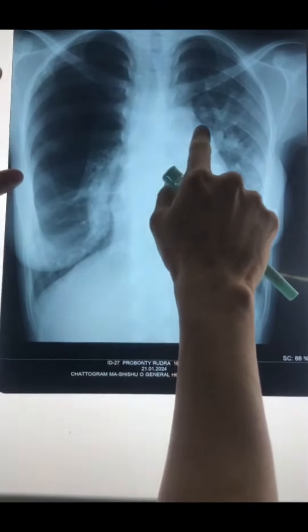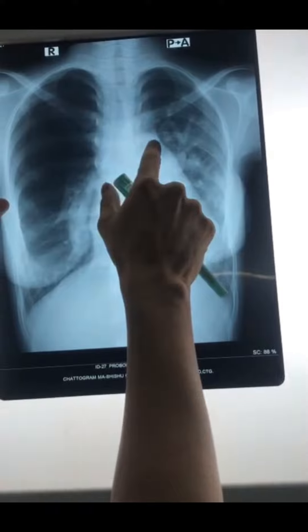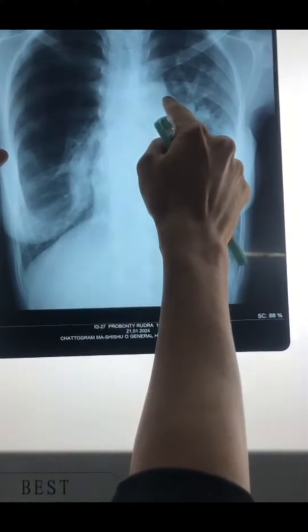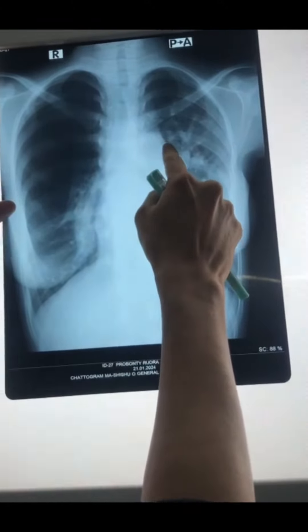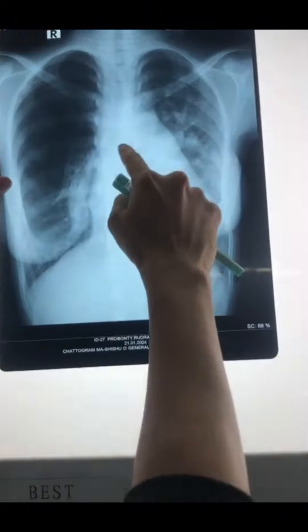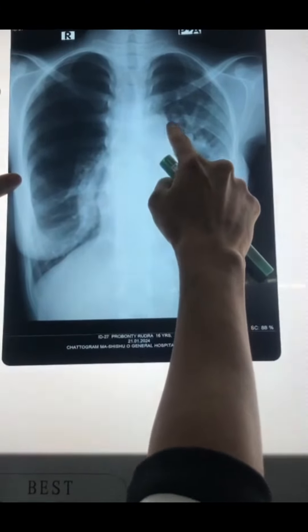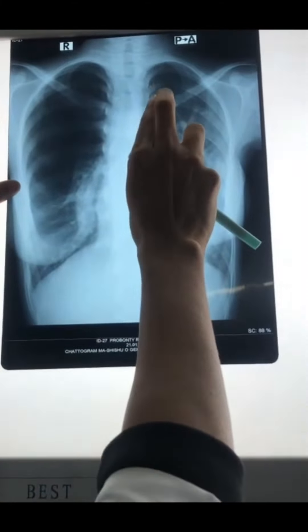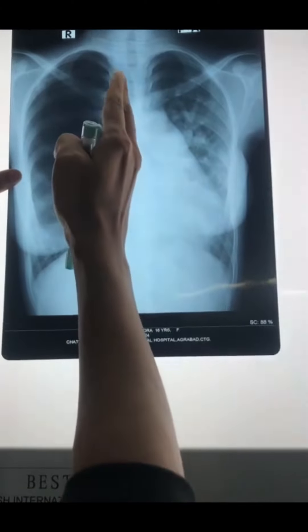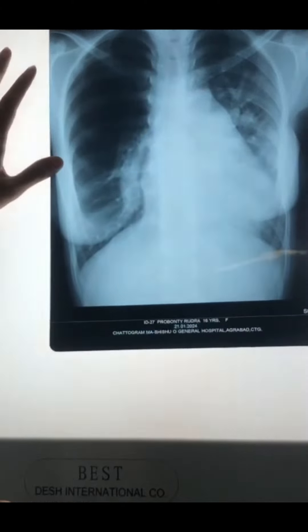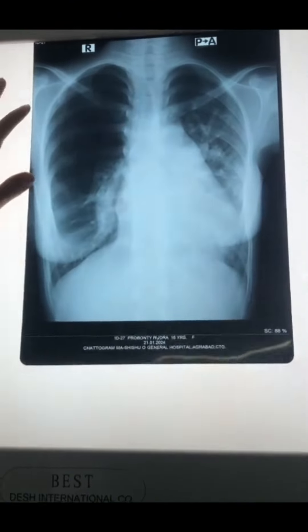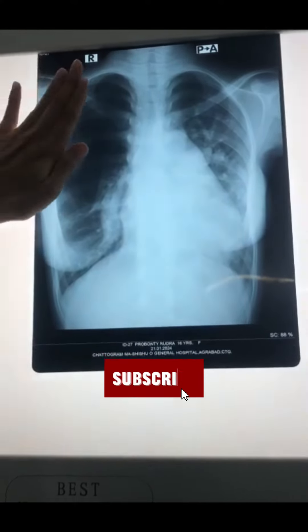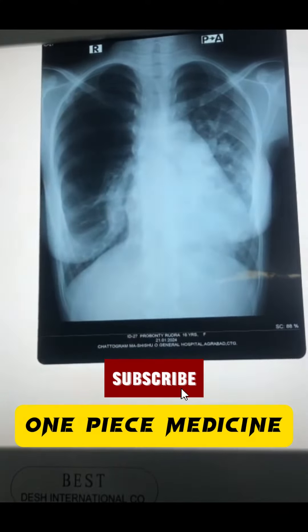This is pulmonary hypertension. The raised pulmonary artery pressure causes the pulmonary conus to appear as a straight border, due to pulmonary hypertension. The final findings are: right-sided pleural effusion with cardiomegaly. Thank you.